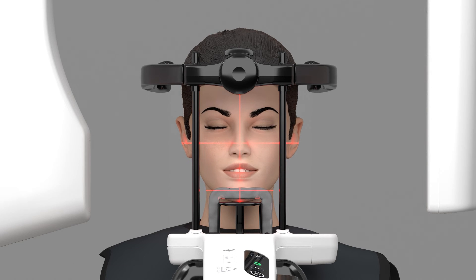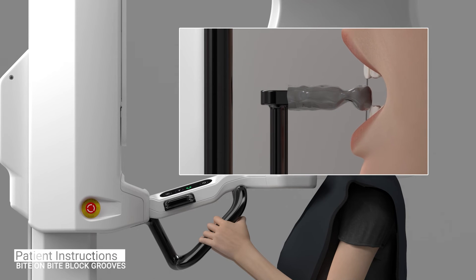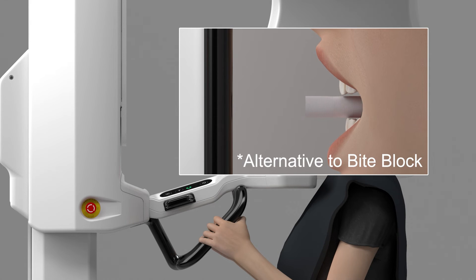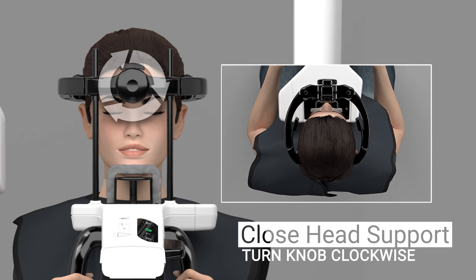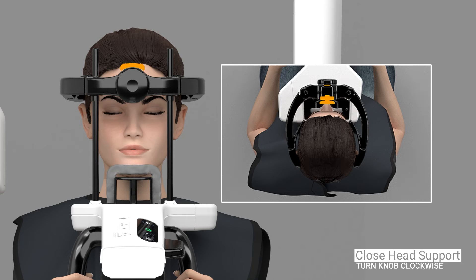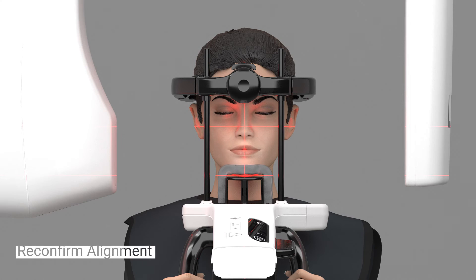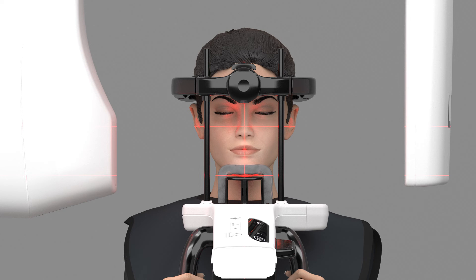Additionally, if the patient isn't required to be in occlusion, install the patient bite block and ensure the patient bites down so both their upper and lower anterior teeth are in the bite block's grooves. Alternatively, place a cotton roll or something similar between the patient's front teeth to separate the jaws. Close the head support by rotating the knob clockwise. Adjust the forehead support so it is resting against the patient's forehead. Reconfirm proper patient alignment using the positioning lights.